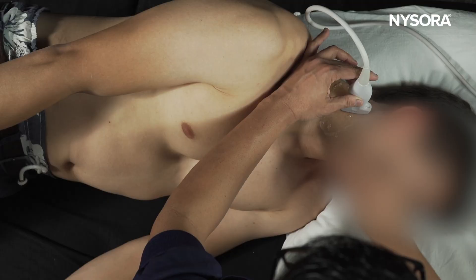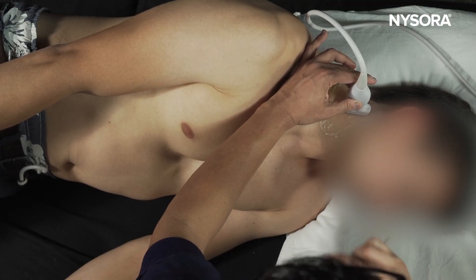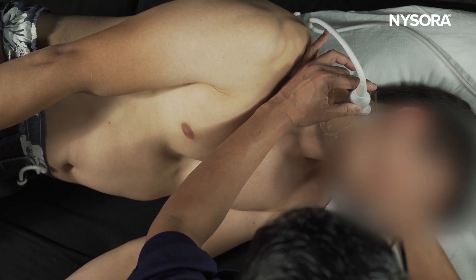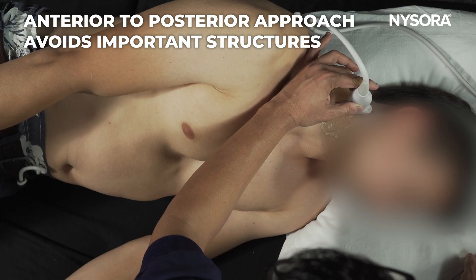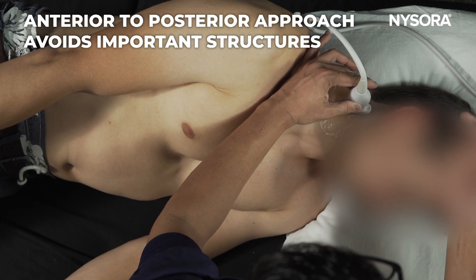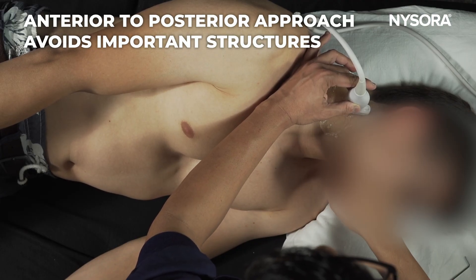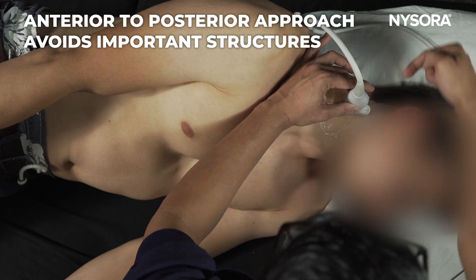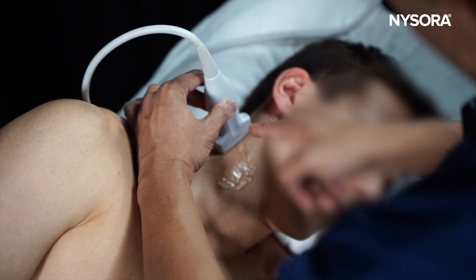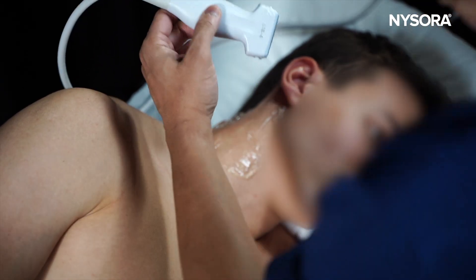The clinical pearl when performing this injection is to always inject out-of-plane from anterior to posterior. The reason is that important structures — the vertebral artery, cervical nerve root, and carotid artery — are all situated anteriorly. If you put the needle from posterior to anterior, you're heading towards all those vital structures. It is always important to direct the needle from anterior to posterior.